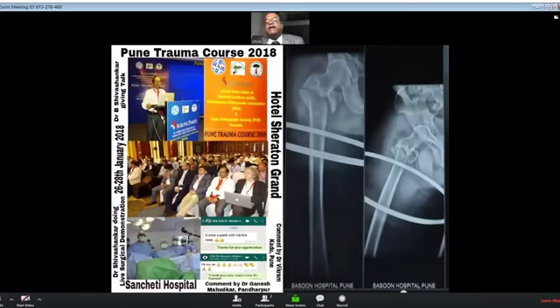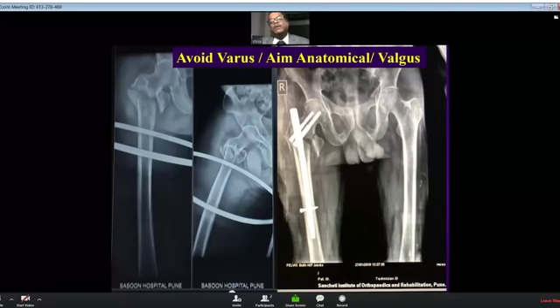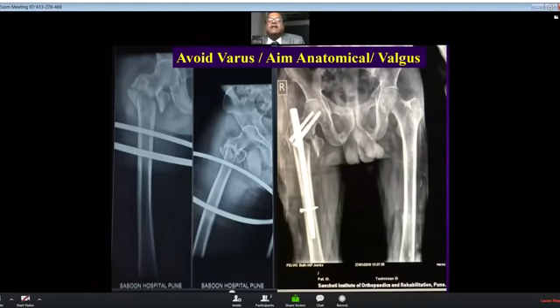Again, a recent case I have done this year only. Here you can see the lateral wall was compromised in this patient. What I did, I just screwed in the screw touching against the nail. The head of the screw is touching the nail itself. So the lateral part of the nail is acting as a lateral cortex. If I had left the screw out a little more outside, there would have been chances for toggling.